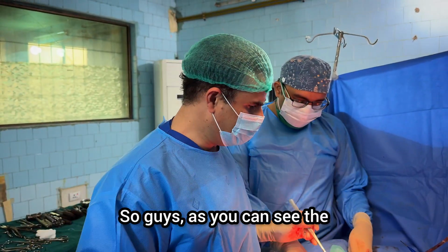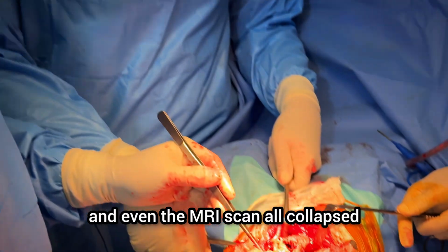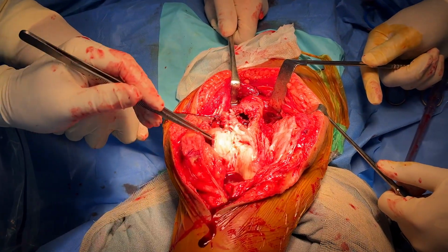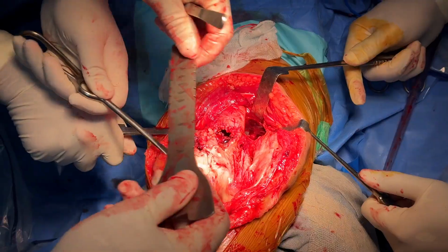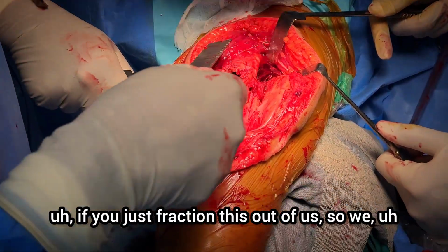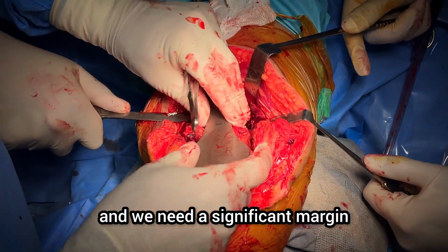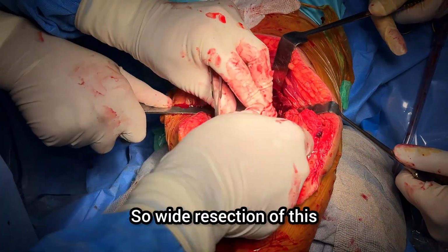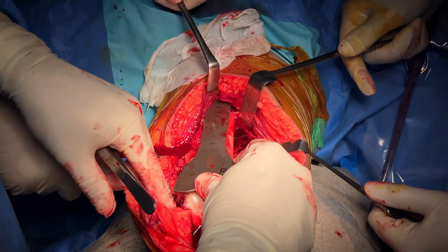So guys, as you can see, the situation is much worse than what it appears on the radiographs, and even the MRI scan, all collapsed, nothing there. So what we're going to do is, if we just fraction this out, we're templating where we're going to take this resection off, and we need significant margins, a wide resection of this. So we put this here, isko seedha karna.